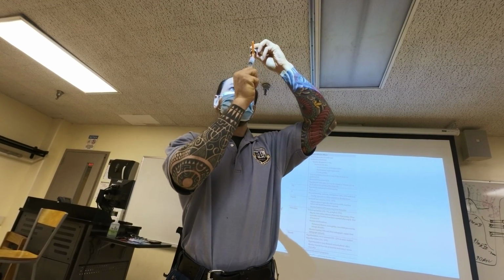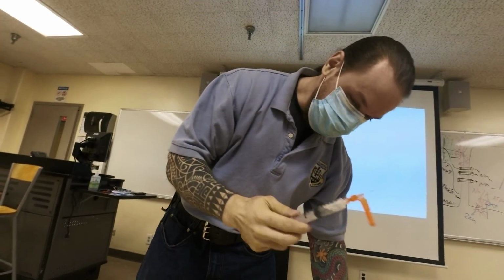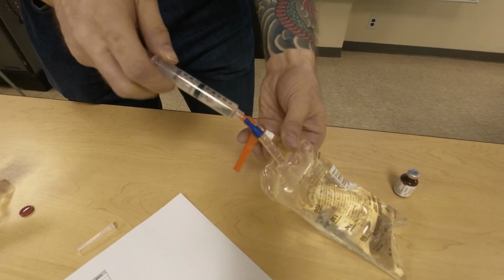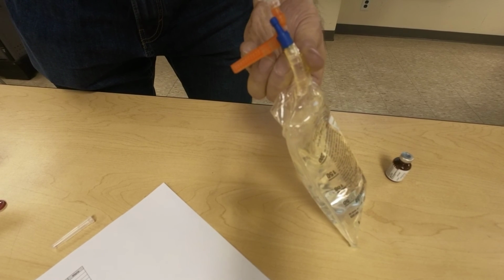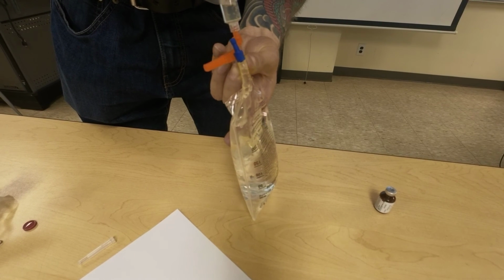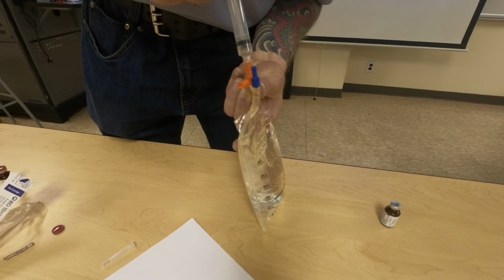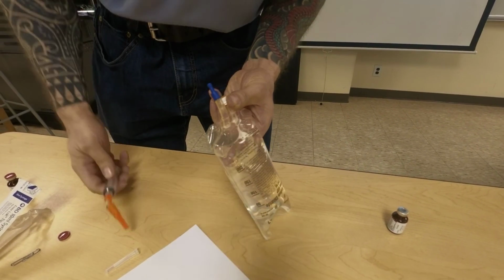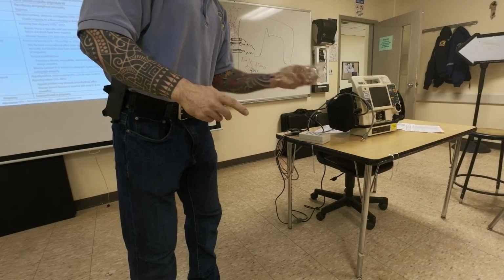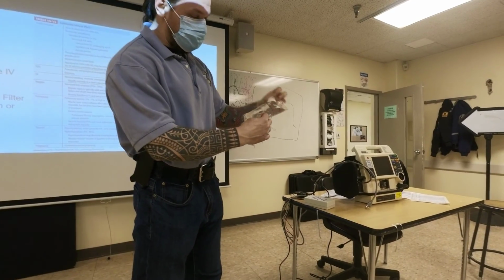That should be enough. So I pulled this out, and what I'm going to do is inject this into the bag of saline. You're going to use your D5W. You're going to cleanse the ports. So look, it's mixed, right? And then you guys tend to do this, because we've got to mix it. And you see what's happening?